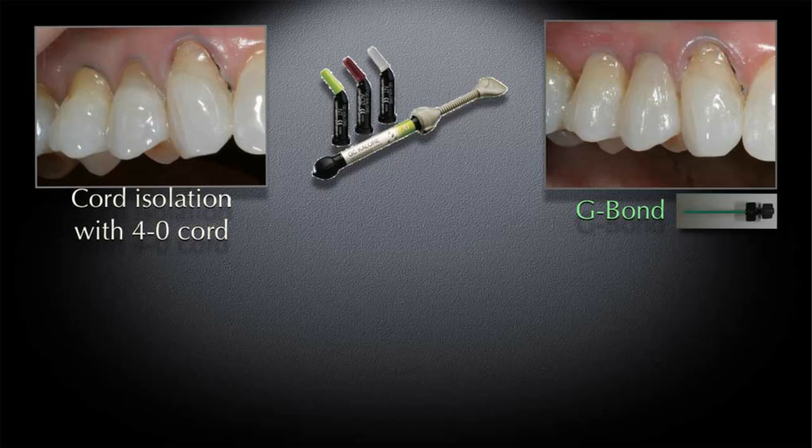When you're using a 7th generation adhesive, be very careful, because the 7th generation adhesive has a side effect of having water molecules develop. And so if you do not remove the water molecules, then when you cure the actual adhesive resin and place your composite on, you may actually run into a delamination of the restorative material because of that side effect that occurs. And so be sure you hit it with air for at least 10 seconds, then go ahead and cure your adhesive, and then you can go ahead and start restoring.